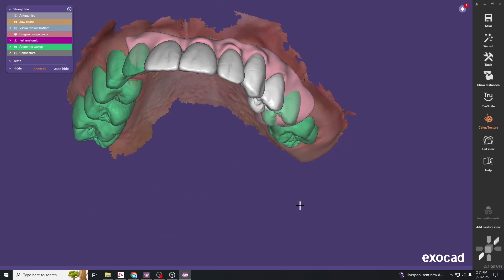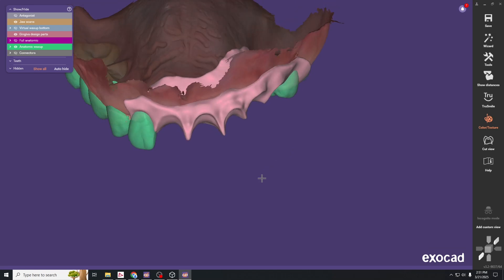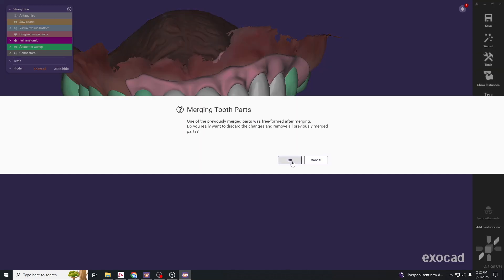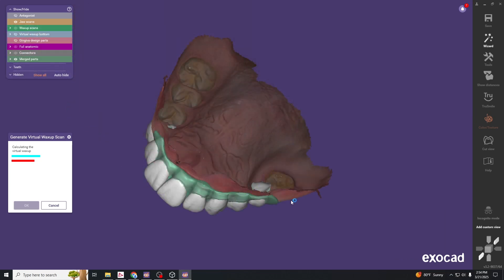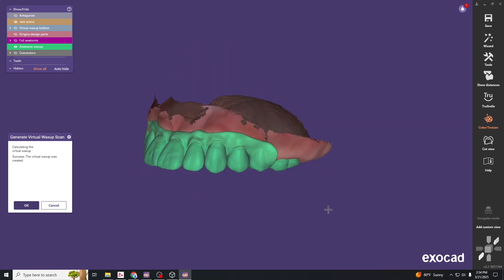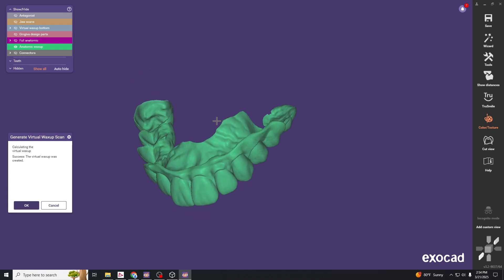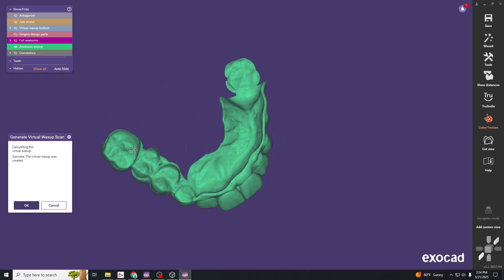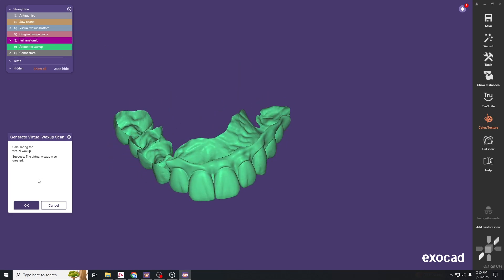This forms our soft tissue; the only remaining step is adapting it to the tissue surface. Hit generate virtual wax-up scan and then OK. Everything is now merged together in one piece, with the teeth cut out so the snap-on smile can fit onto the remaining natural teeth and the soft tissue. Hit OK to continue.